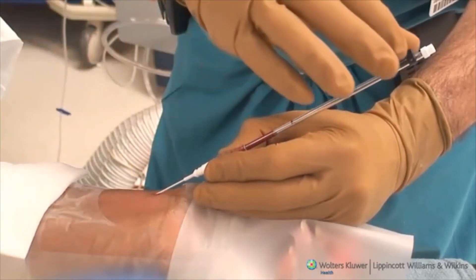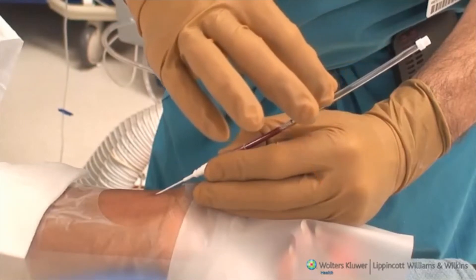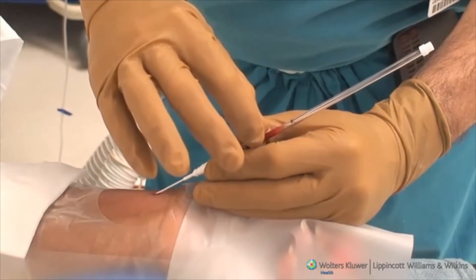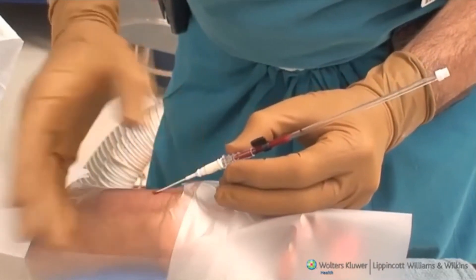The guide wire is gradually advanced. The black line on the plastic column indicates when the tip of the wire protrudes beyond the tip of the needle. The black plastic actuating lever is smoothly advanced past the black line, indicating that the guide wire has entered the arterial lumen.